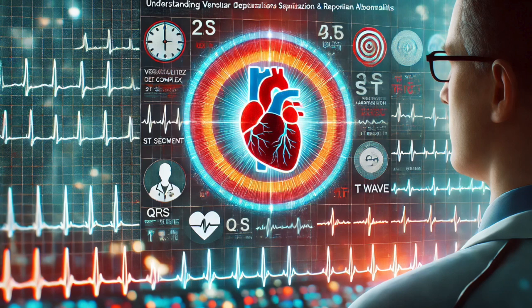Next, ST segment changes. We have ST depression. This indicates a subendocardial injury. The way I like to think about it is ST elevation is epicardial. From the epicardial to endo, this is subendocardial, greater than 0.5 millimeter below baseline, 80 milliseconds after the J point in 2 contiguous leads. So that's the definition of ST depression. Usually seen downsloping or horizontal.